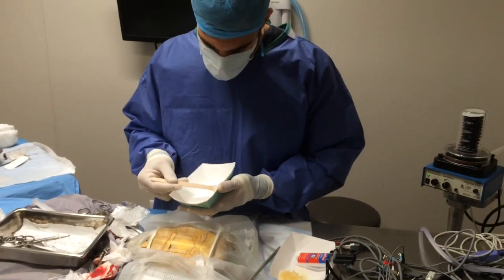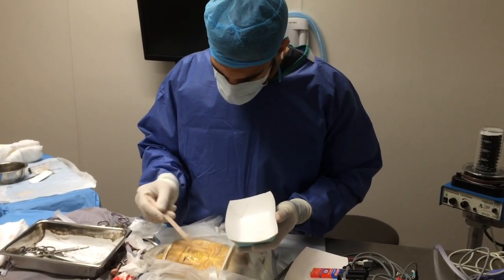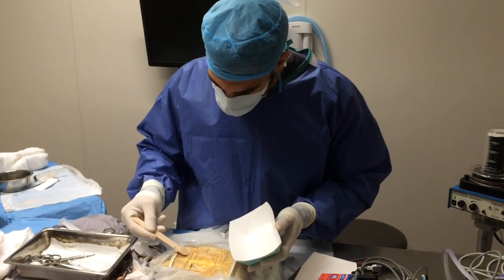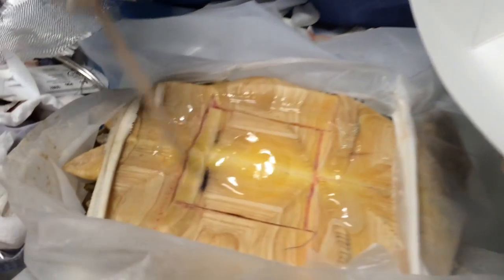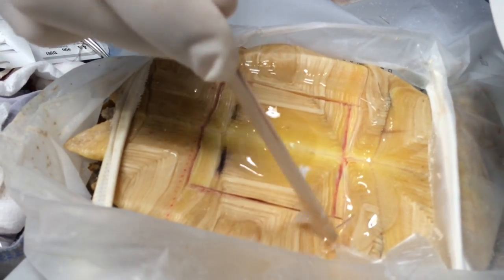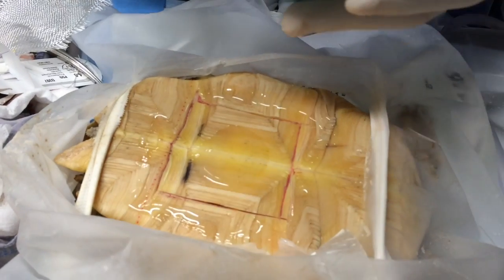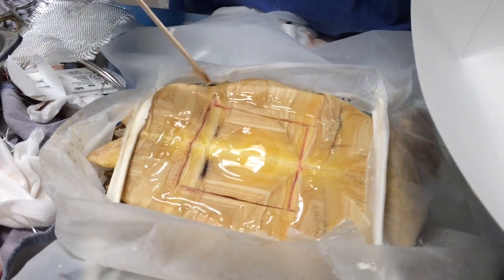We're about to lay the epoxy down — just going to put a little bit in the middle of the shell right here, and some on the sides. What I'm trying to do is avoid going where the shell piece that we took out meets the seam line. Epoxy is pretty caustic and you just don't want it getting in there — I've got a piece of suture line right there. You definitely don't want it getting into the coelom, the abdomen equivalent for reptiles, where all the organs are. If it gets in there it could cause a serious inflammatory response.